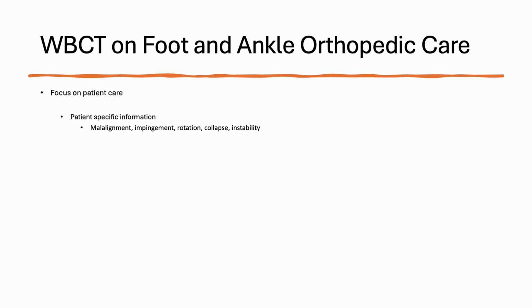And the nice thing about it, which I didn't talk about, is that it's a relatively small footprint. You can plug it into a regular wall. It's relatively inexpensive and pays for itself pretty quickly. I think on average you have to do 14 scans a month for it to make you roughly $250,000 throughout a calendar year. So you don't have to be super heavy on it.